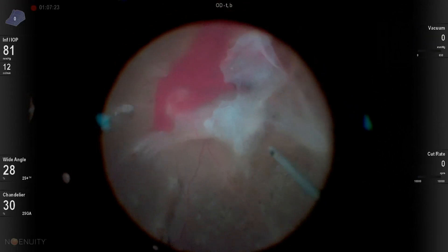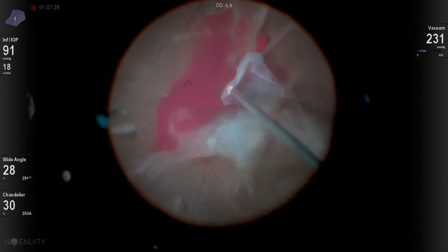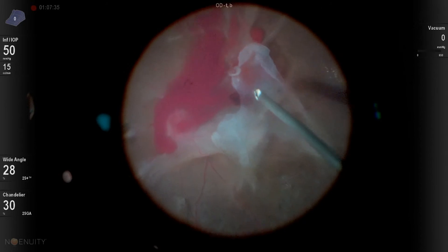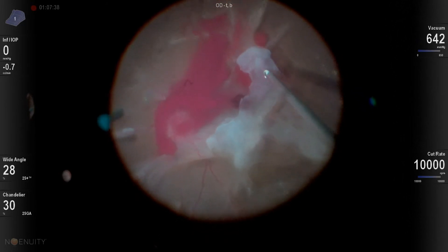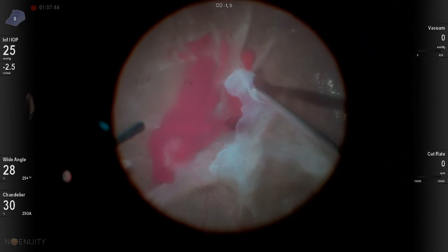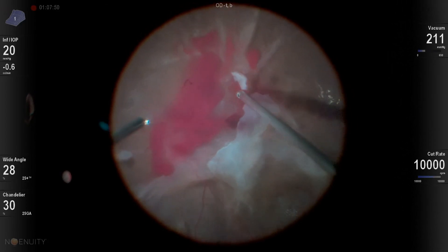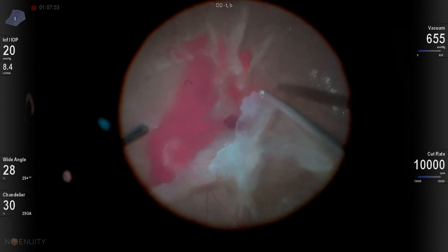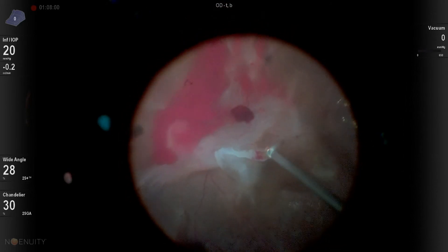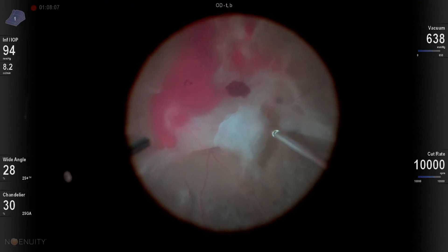When I pulled that up, I could actually see that there was space between this fibrotic plaque and the underlying retina — and I want to find those areas of space. Here I'm using my cutter as a forcep. The nice thing about this is that it will release before it pulls and tears the retina in all likelihood. I'm using a forehanded technique and also a backhanded technique where I'm moving the cutter backwards over the fibrotic plaque. I know there's space there because when I lifted up that fibrotic tissue I could see room underneath. Now I find this crevice that I can go through and segment.